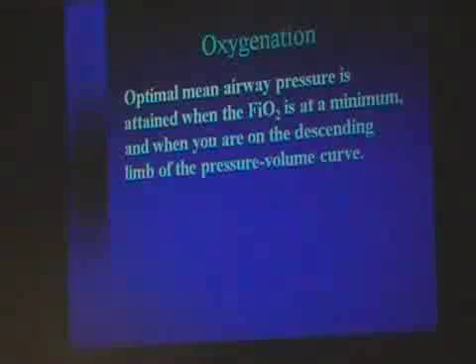And remember when we said last time, if you've got a high FiO2 on this baby, the first question you should ask yourself is, am I at my optimal mean airway pressure? That's why we say, okay, this baby's ready for weaning. His FiO2 is 35%. Okay, let's wean him. Well, I come back half an hour later, his FiO2 is 30%. Okay, let's wean him again. You wean, you wean, you wean. As long as your FiO2 is going down or staying the same, you know that you are at your optimal mean airway pressure. The trickier part is, where are you on the pressure volume curve?